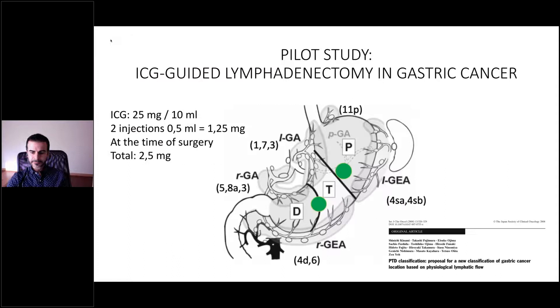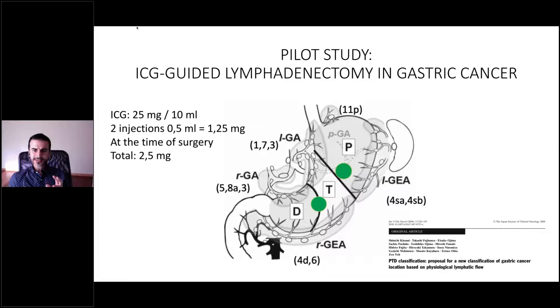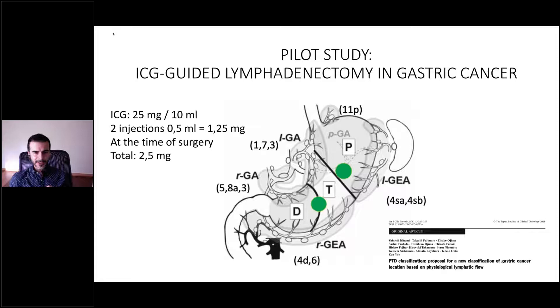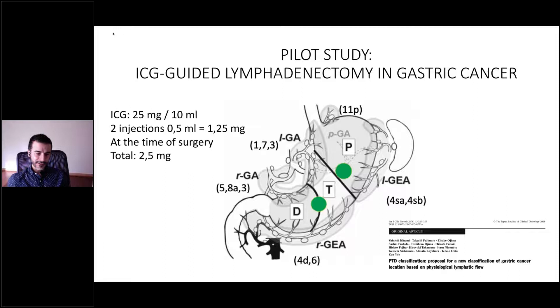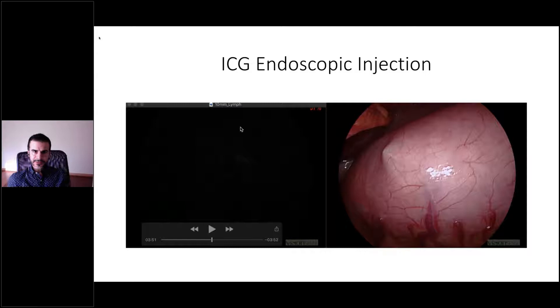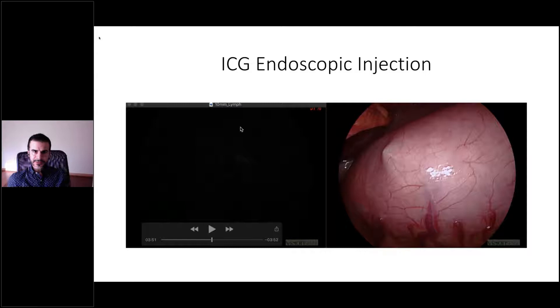I will now show my personal experience. Our pilot study includes patients with gastric cancer. Based on the classification of physiological lymphatic flow described by Japanese colleagues, we perform two injections of ICG: the first at the union of the upper third with the middle third of the stomach, and the second at the union of the middle and lower thirds. The total ICG injected is 2.5 milligrams and the injection is performed at the time of surgery, as shown in this endoscopic injection video.